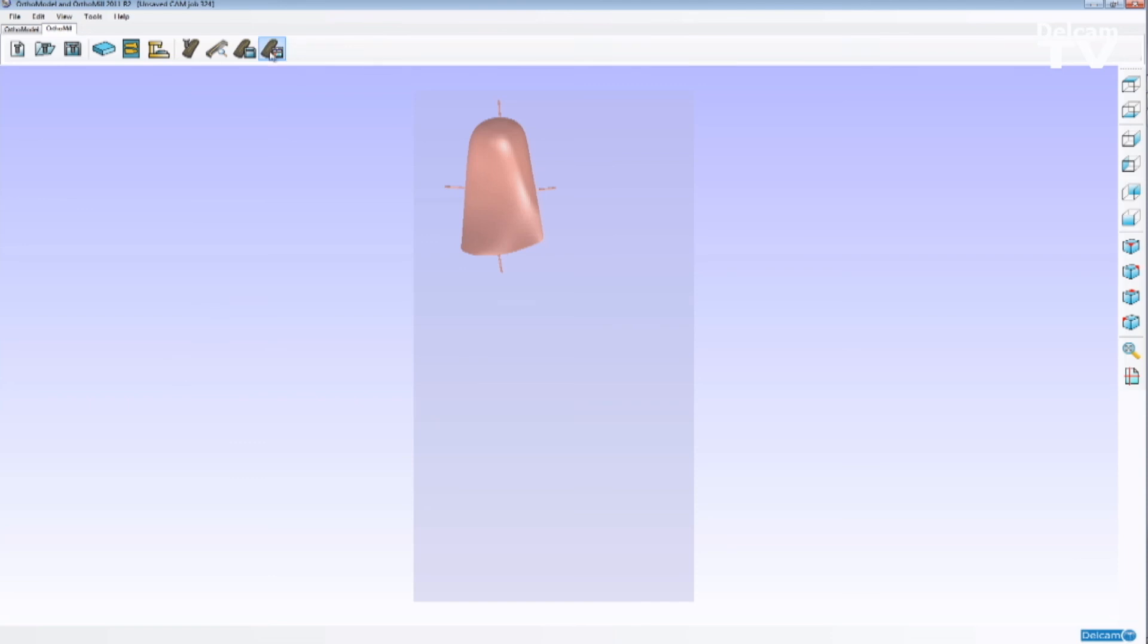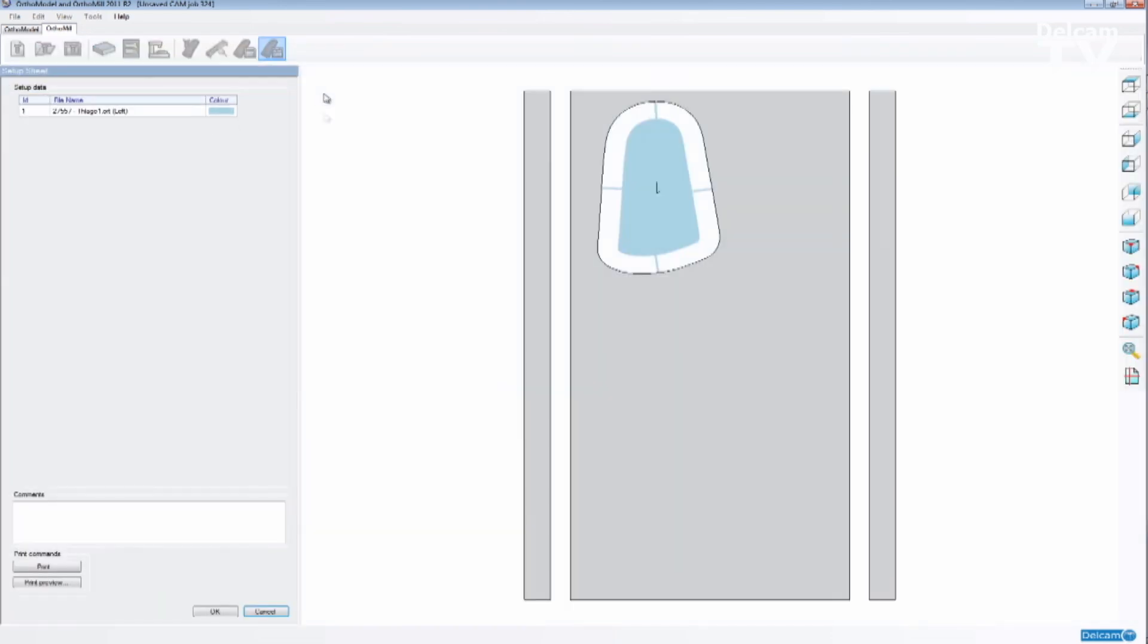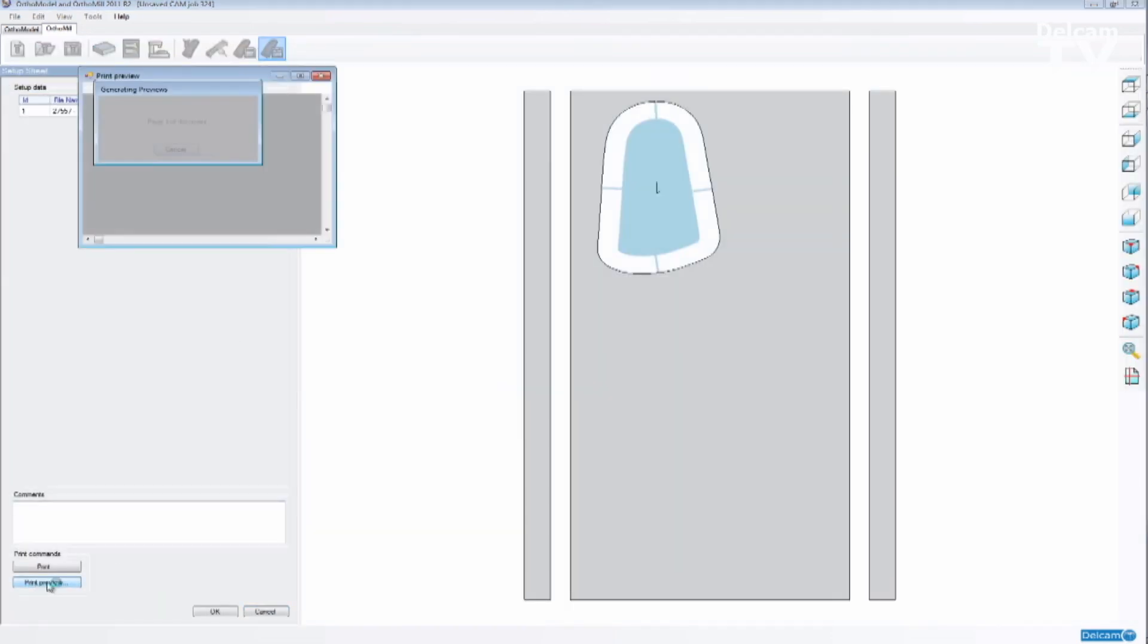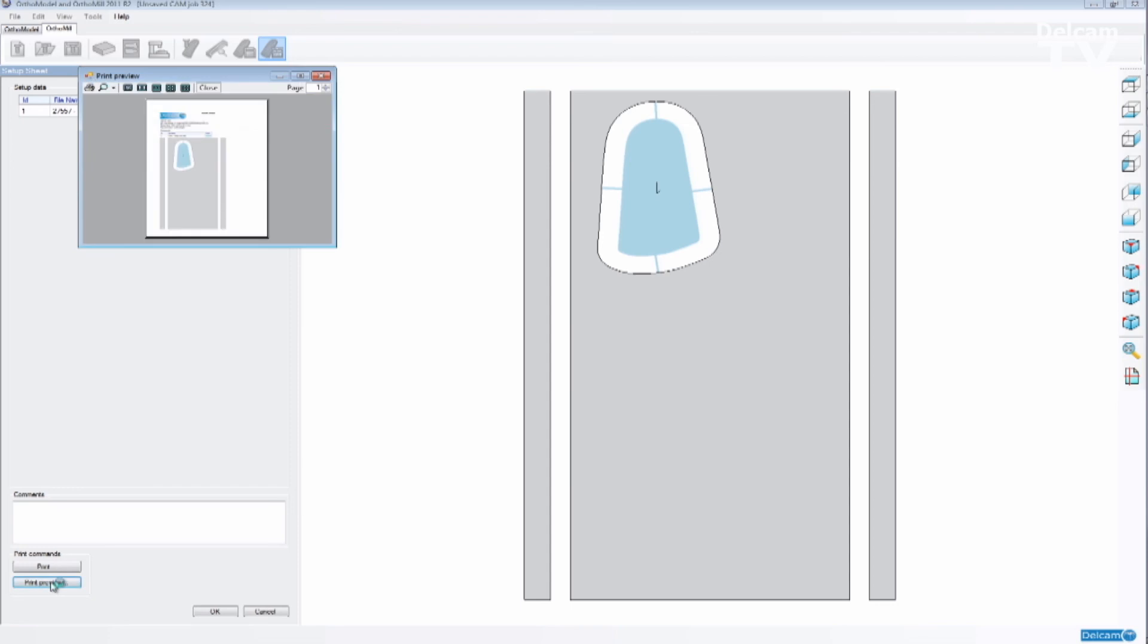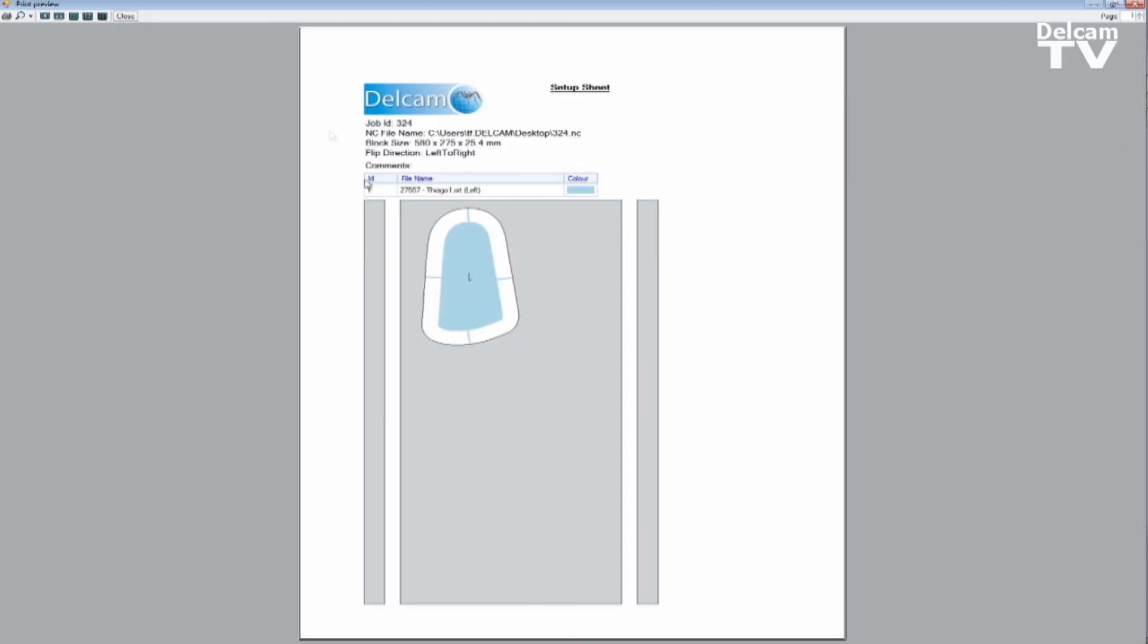So once we are done, OrthoMule also creates a setup sheet that tells us where we have saved the G-code, the sizes of the block and what patients have been placed on the block as you can see on the picture below.